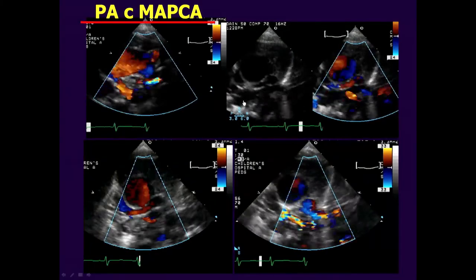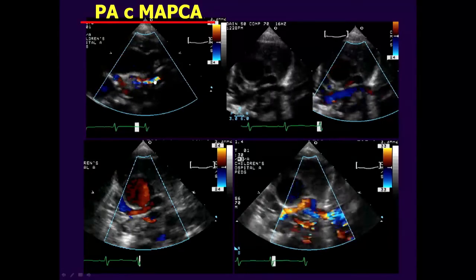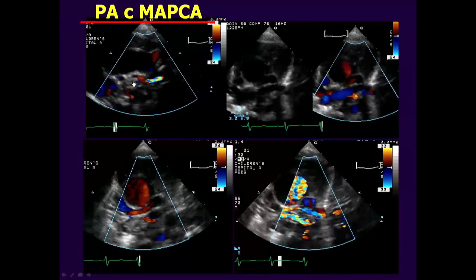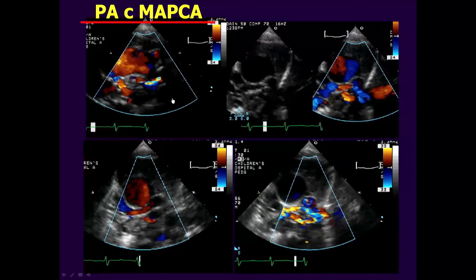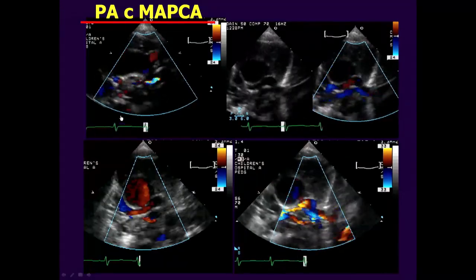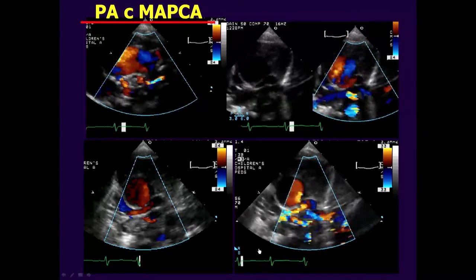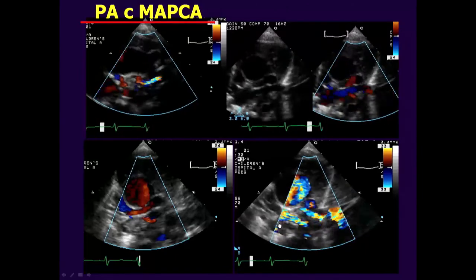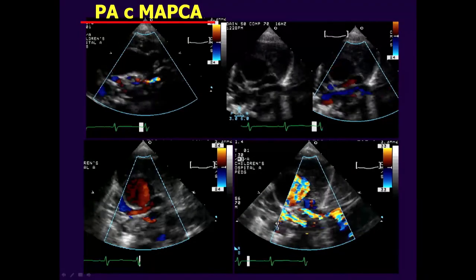And you can see here the aorta, and then this is a very, very small pulmonary artery, but we don't know whether this is a native pulmonary artery or not. And there are a lot of major aortopulmonary collateral arteries, because this is a pulmonary atresia case. So in echo images, we can notice where the flow goes, and where the flow connects. And then before catheterization or some intervention or surgery, we can clarify where the MAPCAs drain into.